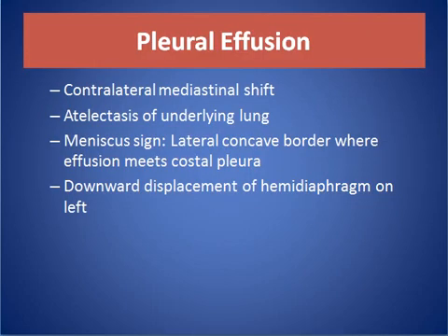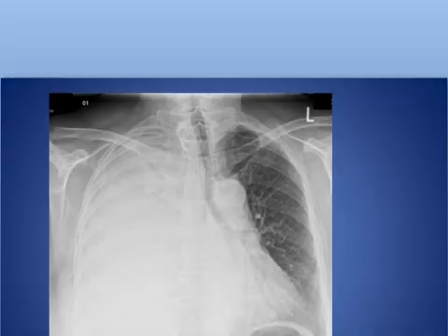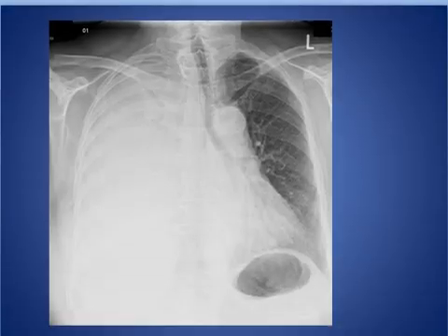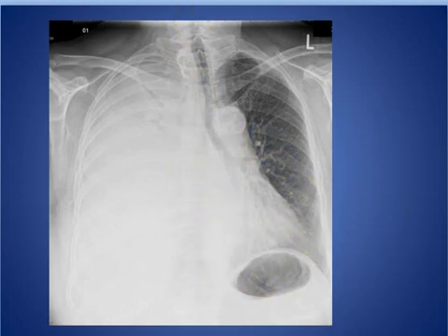The clues for the common diagnosis of pleural effusion: there is contralateral mediastinal shift, atelectasis of the underlying lung, we have a meniscus line, lateral concave border where the effusion meets the costal pleura, and downward displacement of the hemidiaphragm on the left side. Here we have a large amount of right-sided pleural effusion with mediastinal shift of the heart and trachea to the left side.